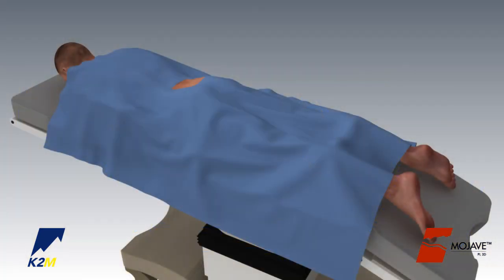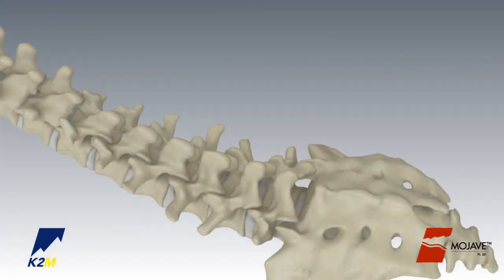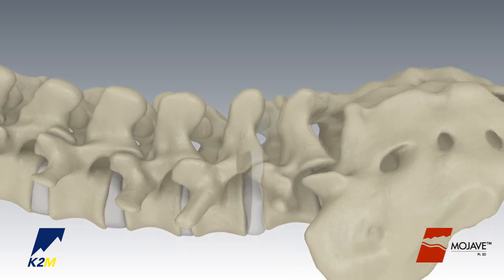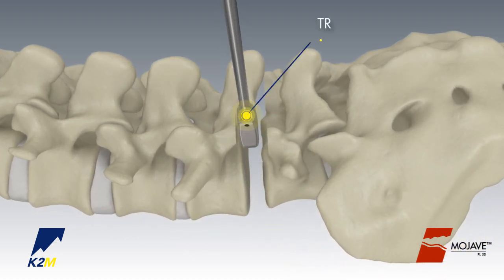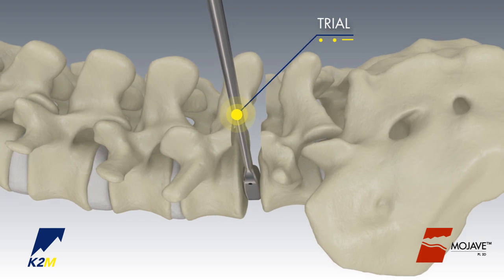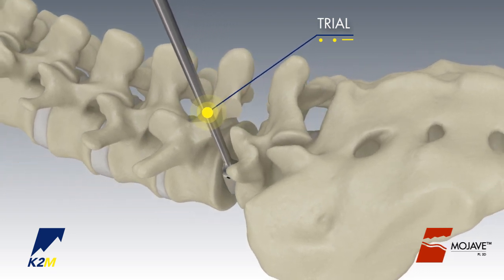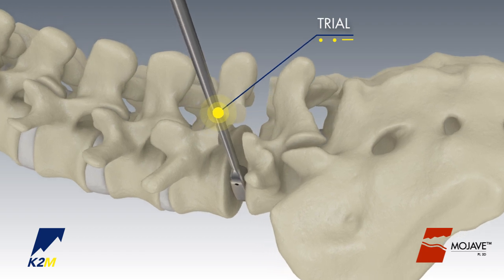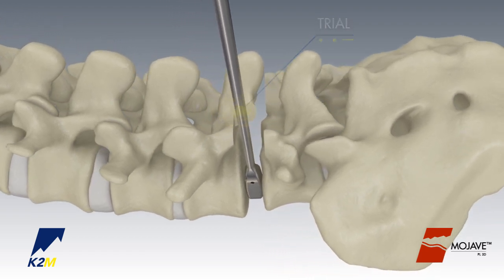Perform a standard incision and exposure of the posterior lumbar spine and then complete a standard discectomy. Insert the trial into the disc space to aid in initial test fitting and size confirmation of the interbody. To determine the proper implant length, use the scallop and hole on the proximal end of the trial body.